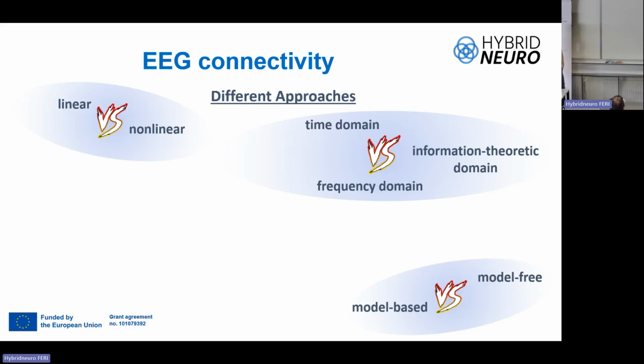Another classification can be in time domain or frequency domain. Frequency domain is especially interesting in brain connectivity because remember that these statistical dependencies are not only for EEG, but for any biomedical signals or any signal. For example, we have used them for cardiorespiratory interaction, the heart and the breathing, also interaction between respiratory and respiratory muscles activity, coordination when you have a pulmonary disease. So it is very open, no? But in this case, it's for EEG.